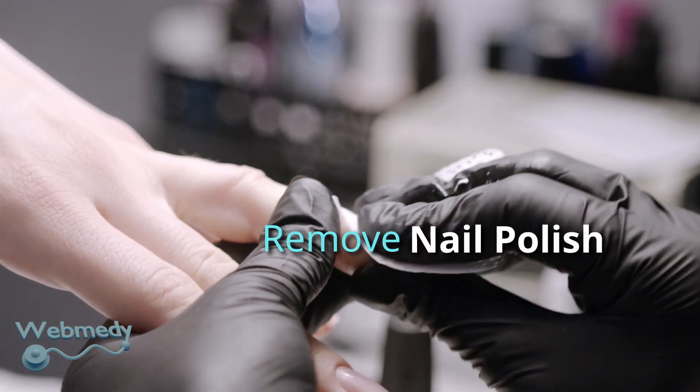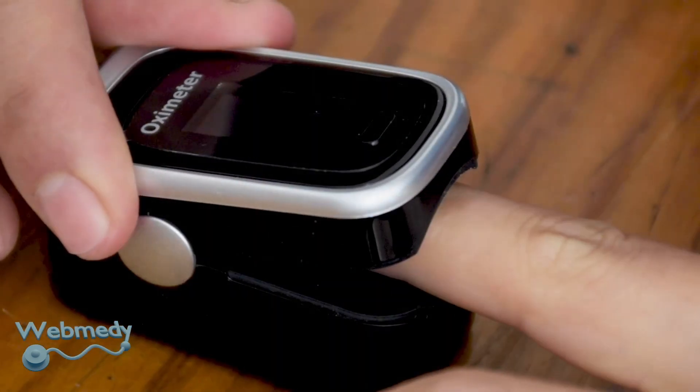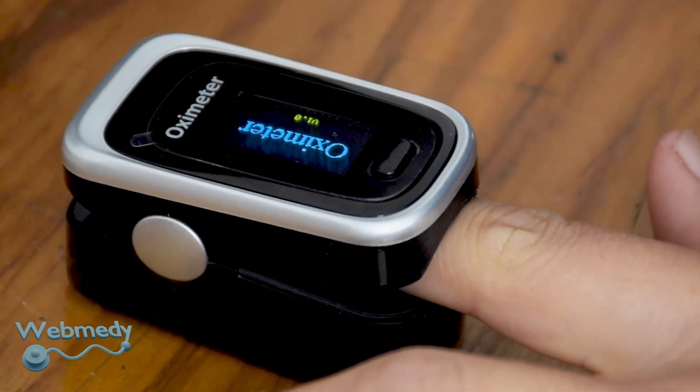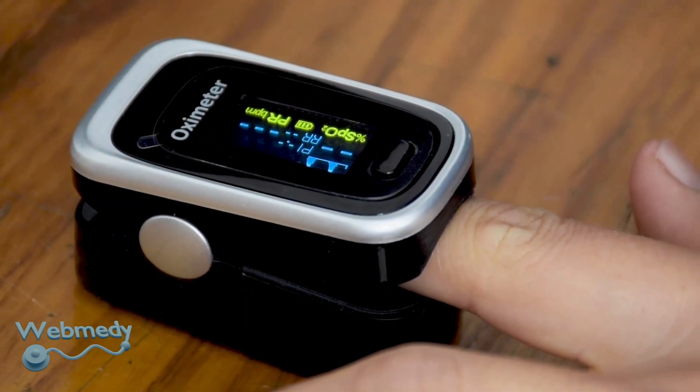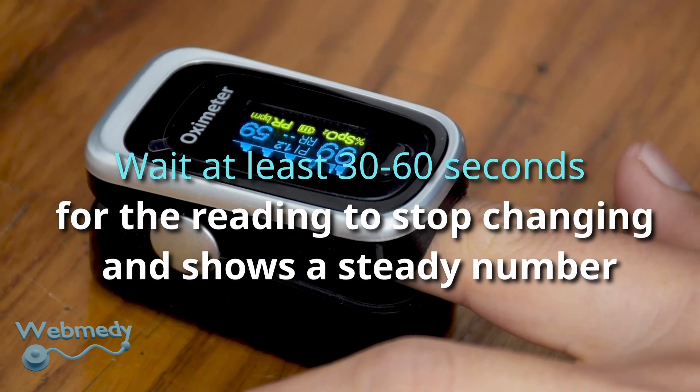Remove any nail polish on the finger you are using. Insert your finger into the device and press the button to start taking the reading. Wait at least 30 to 60 seconds until the reading stops changing and displays one steady number.